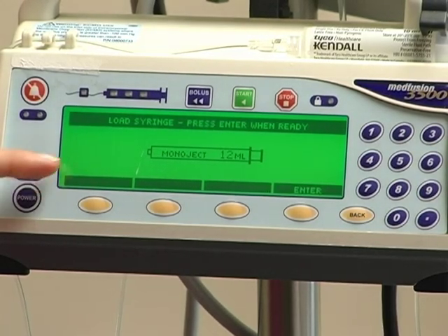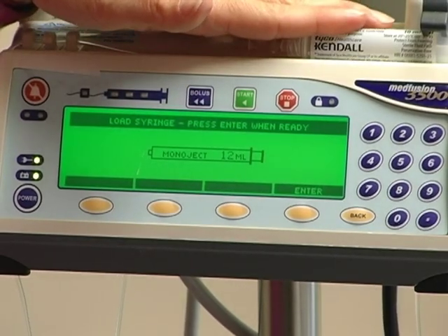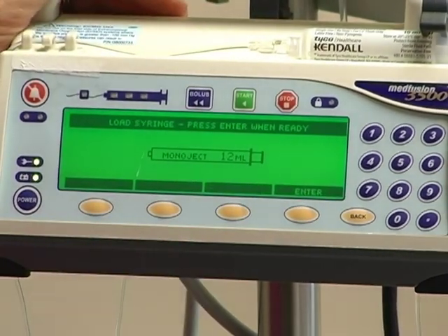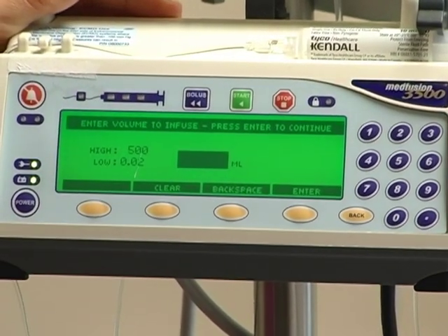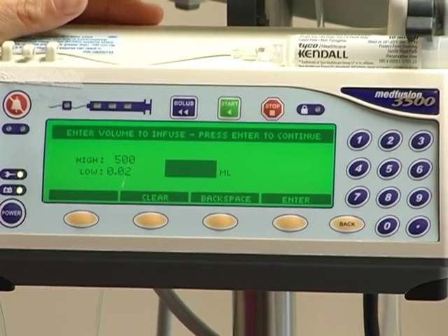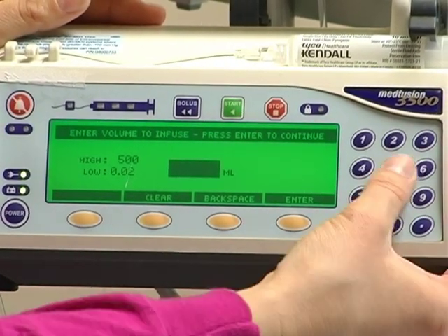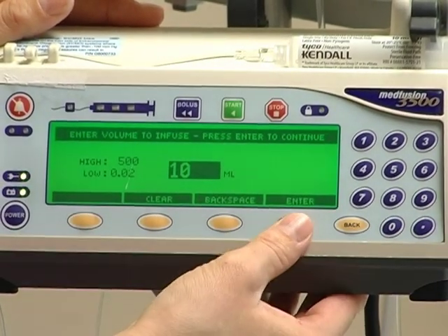The third screen will recognize what size syringe you have in place already. It recognizes a 12 ml syringe, and again you just press enter. The next screen will ask you to enter the volume to infuse. So whatever your volume is that you would like to infuse, you just type it in — for example, 10 ml — and again just press enter.